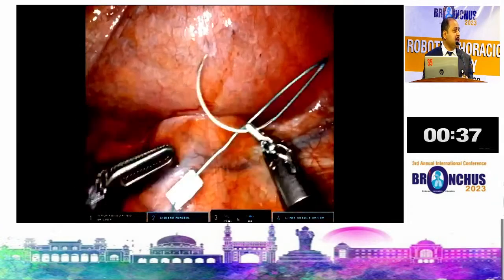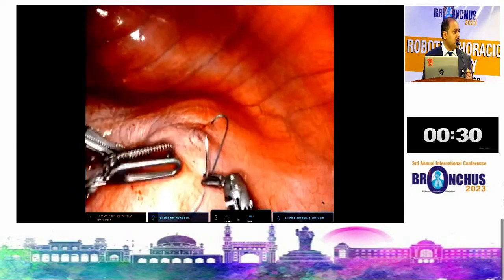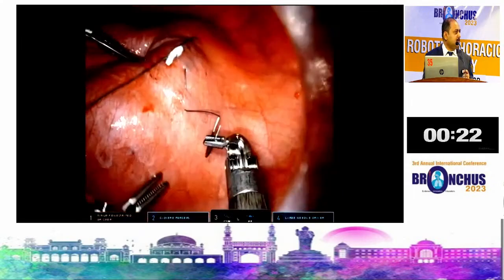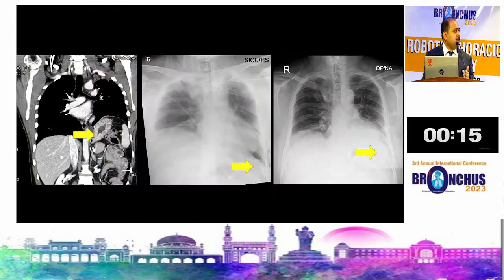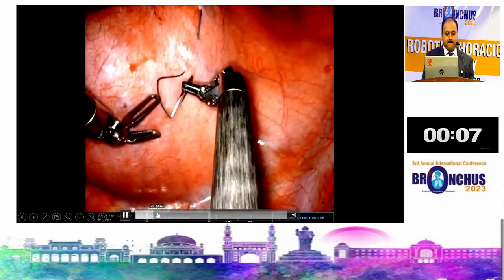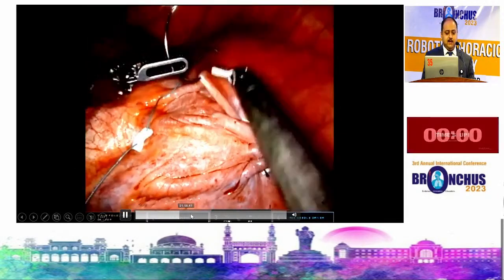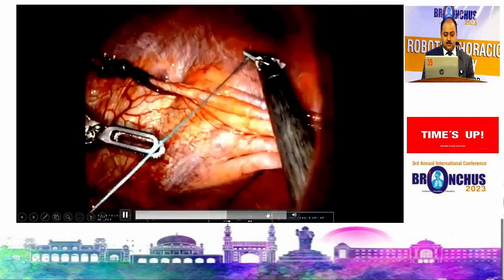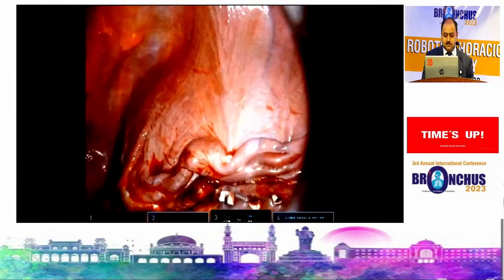where we see always while doing the robotic diaphragmatic plication, you have to lift the diaphragm and suture it, because there are intra-abdominal organs lying beneath it. One should not injure them, otherwise you may land in trouble. So lift the diaphragm and then pass the needle, always. Non-absorbable sutures. And then robot is especially helpful for tying the knots intracorporally. So multiple pleats can be created. And the final outcome will look like this.